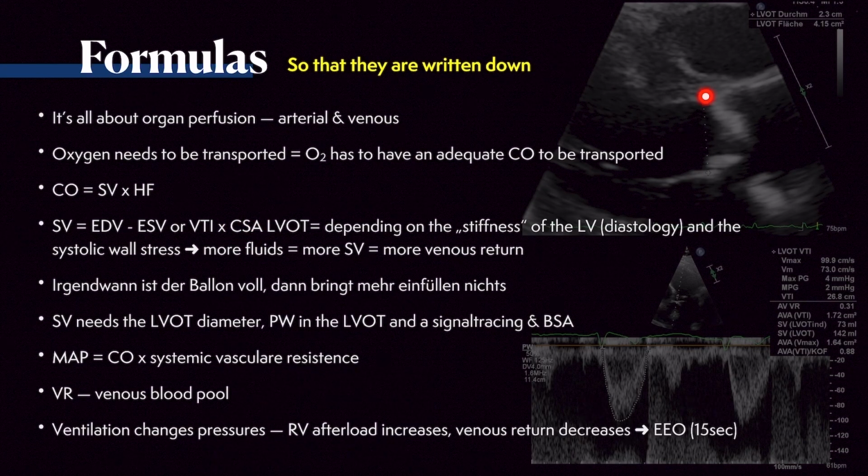You see here this measurement. This is the cross-sectional area you can measure in the parasternal long axis view. Here's the calcified aortic valve. So here you would place the measurement a little bit over, measuring in this area optimizes the measurement. But if you want to know more about the aortic stenosis and how you perform these measurements, take a look at the videos where the aortic valve and the aortic stenosis are discussed.